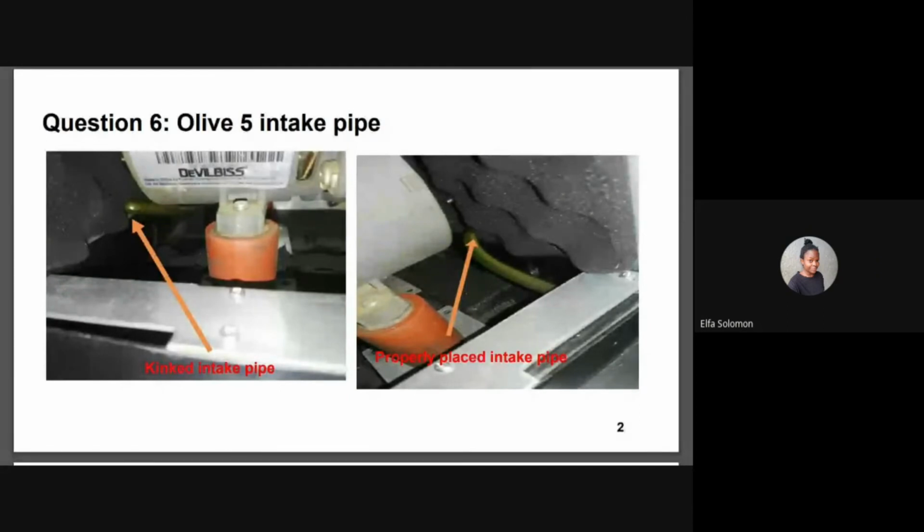When the compressor is running, it becomes hot, making its surrounding air hot also. And the intake pipe gets hot as well due to the increase in temperature of the surrounding area. As time goes, the intake pipe starts deforming since it's plastic. As deformation continues, the intake pipe loses its shape and develops a sharp bend as shown in the graphics.